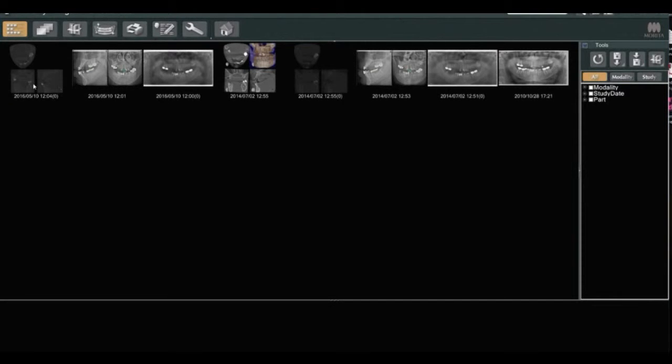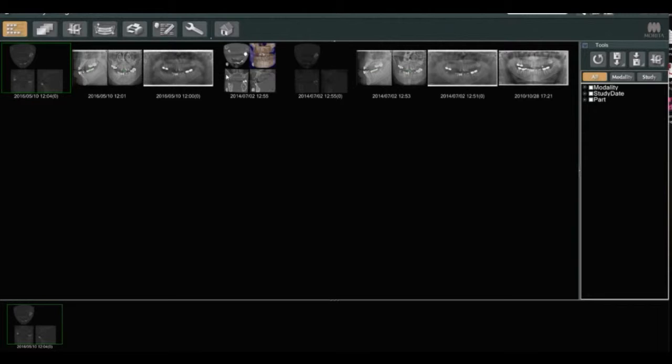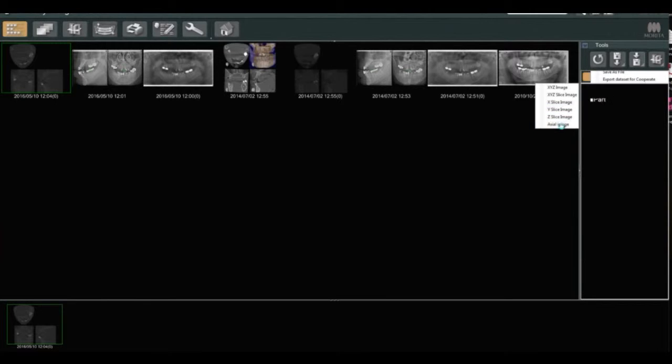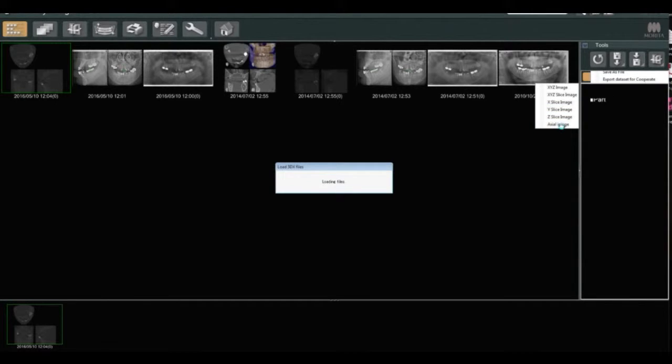Morita CT Scan Equipment: How to Export and Upload to ROE. Highlight the image that you want, then click download, save file as, and pick the axial slice.